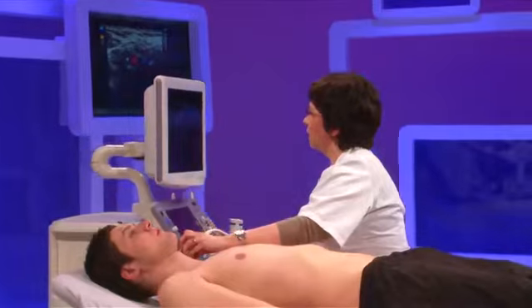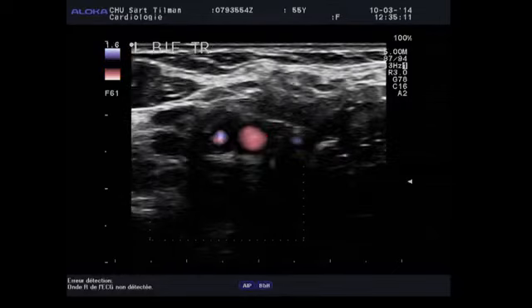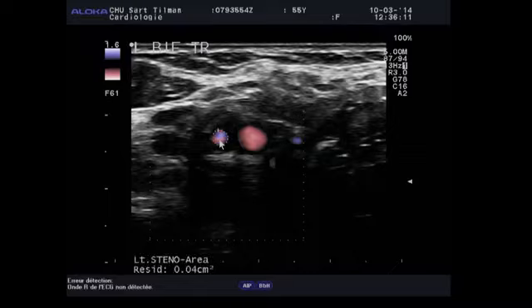Here is the internal carotid artery in color Doppler. This is the external one, and you can see here the aliasing. So there's a severe stenosis, but as you can see with E-flow, the stenosis looks less severe, because E-flow gives a better definition of the edge of the internal channel. And you can use the E-flow to measure the stenosis by the area method.